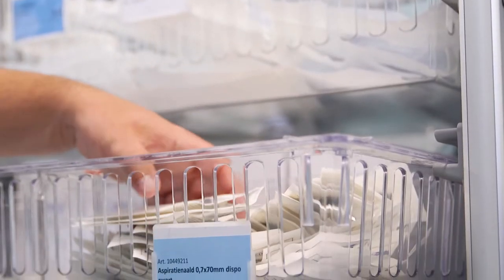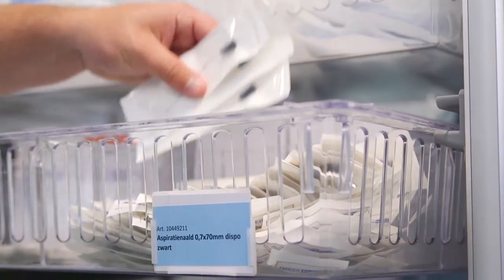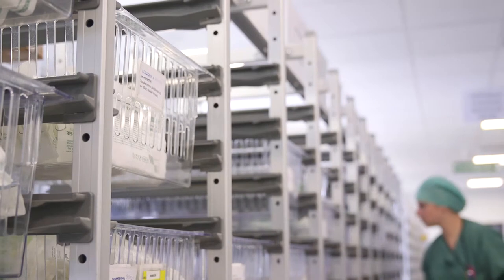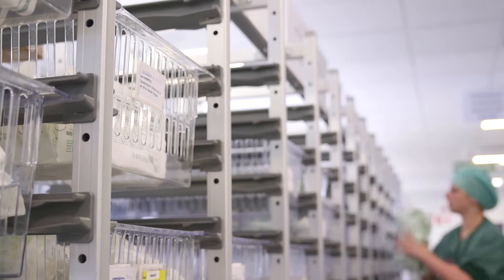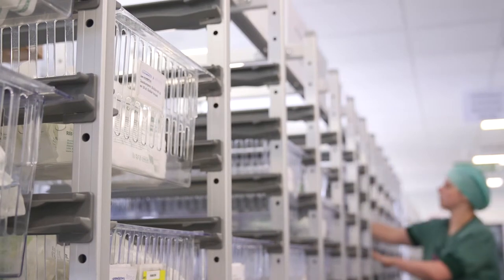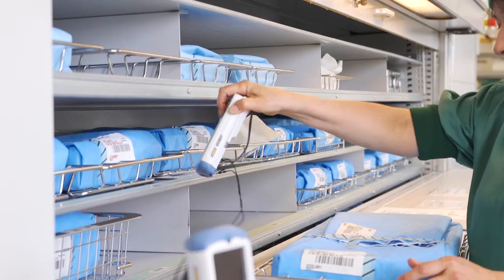Besides surgical instruments, also implants and consumables can perfectly be integrated.